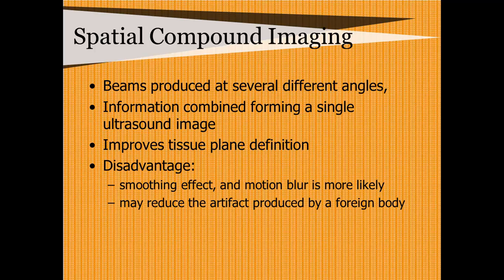This happens often if you're looking at kidney stones and you put on your spatial compounding. You don't see any shadowing from echogenic foci. Well, take it off, and there you go. You can send a pure beam in, and you'll see a shadow behind the calcium.